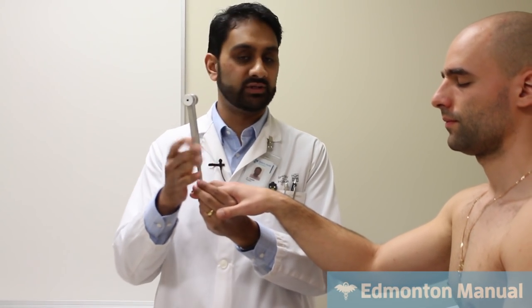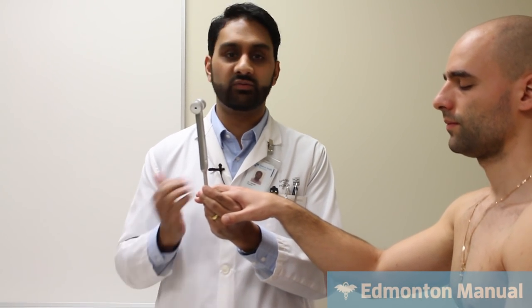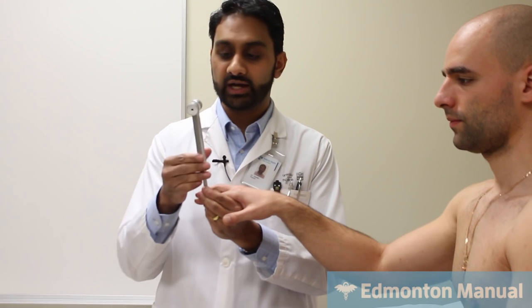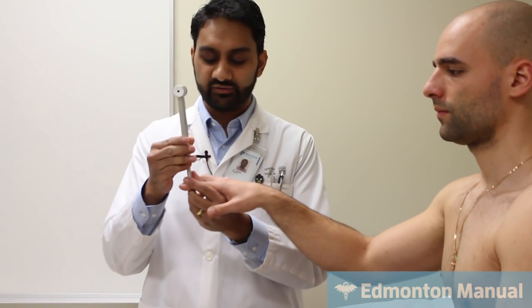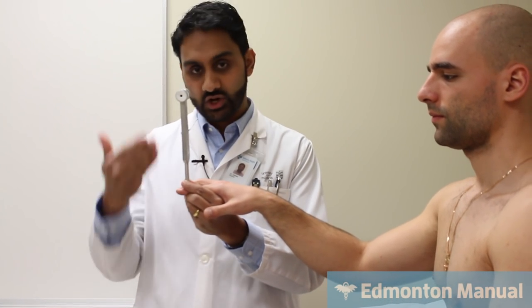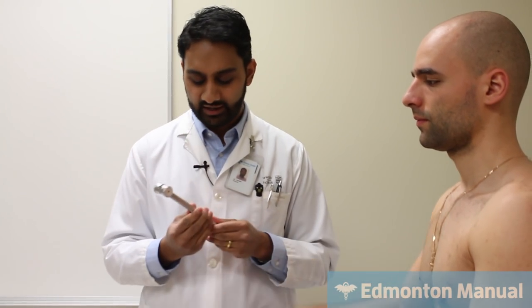Occasionally you'll have patients where it's vibrating, you stop it, they still don't say it stopped, which raises the question of whether they actually felt it in the first place. The other thing that can happen is if it's quite extreme, if I can actually feel the vibration through his finger on the bottom when he tells me it stops, so I know it's clearly vibrating, that would be abnormal as well. But that's a way that you can use the 128 Hertz tuning fork.